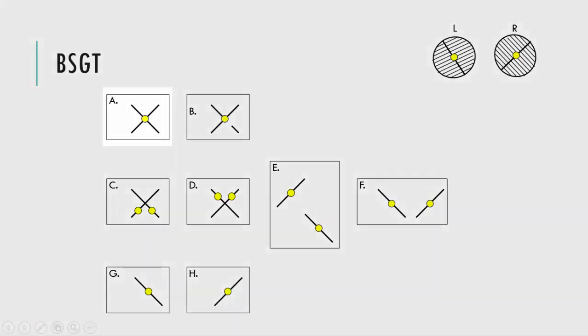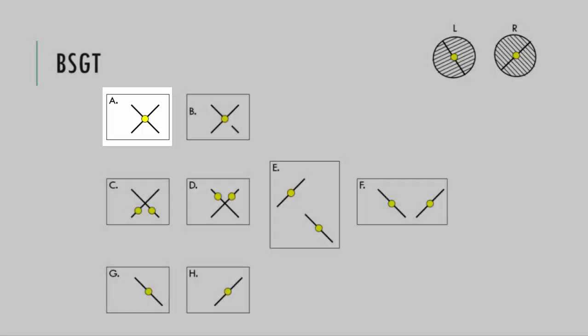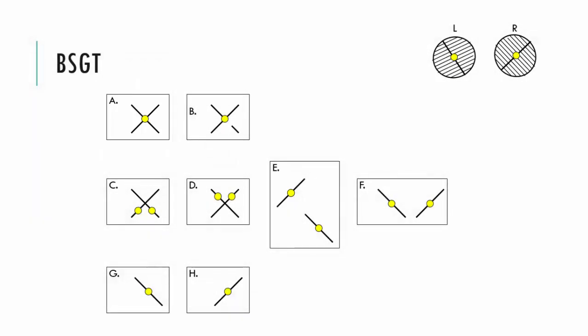So a patient who has BSV will see a cross, as we see here. They will see one light because they will fuse that one light, one being seen from the right eye and one being seen from the left eye. And the lines, because they're in different orientations, will both be seen. So one is coming from one eye, and we can see this one here is coming from the left eye, as it's the same as that one there, and this one here is coming from the right eye, as it's the same as this one.